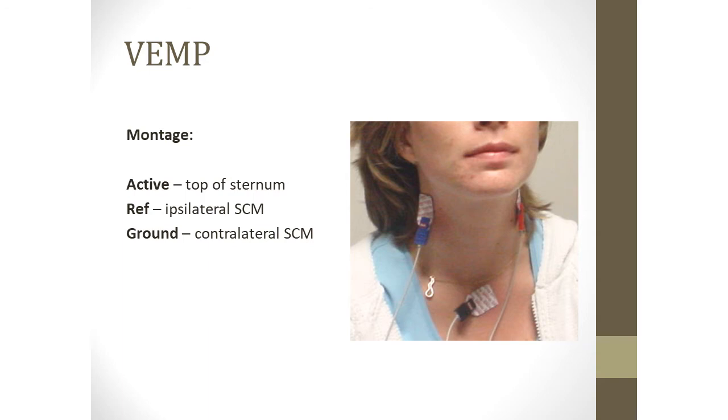And so I was wishing we could put it somewhere else. Then I was at a conference, and Dave Cipolla was talking. He's a statistician with the Mayo Clinic. He said he felt the same way I did about putting that electrode here, so he said, I'm going to do a research project. I'm going to just put it on the forehead and see if it makes any difference clinically. And it didn't. I said, David, that's the best thing I ever heard, because from now on I'll put it on the forehead. It'll be so much easier. So that's what we do.